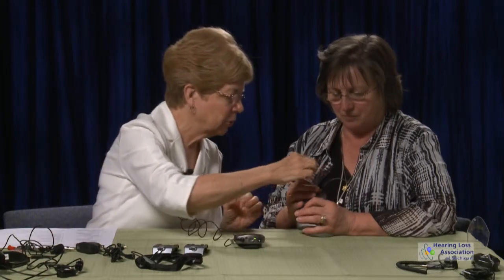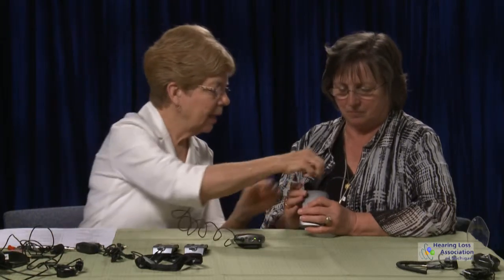So what you want to do here is have this mic placed about 2 to 3 inches from a person's mouth, and just clip it on. Make sure that it's facing toward the mouth. If it's facing off this way and I turn my head in the opposite direction, it's going to be more difficult for you to hear. But you are hearing me comfortably. You have a volume control on the top. You turn it on, and as you turn it on, you see the green light is coming on. Okay, and that is comfortable, right?